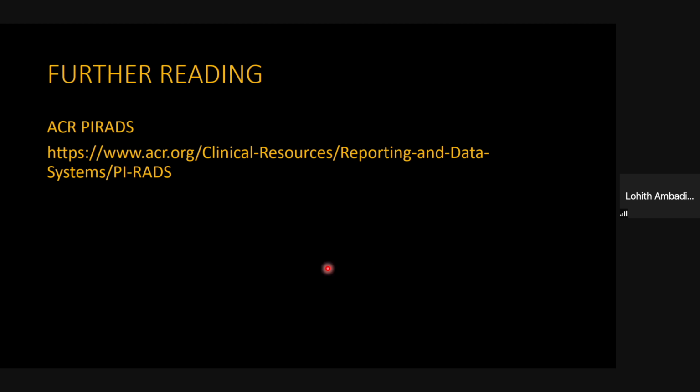And the ACR PI-RADS document is an open access document. It has got the entire technical specifications, lexicon, few sample images, sample report, everything is available, open access. Please do have a look.